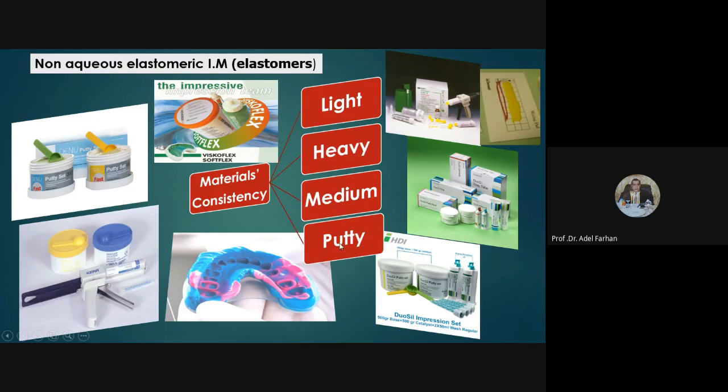طبعا الكونسستنسي تعتمد على شنو الاماونت اوف فيلر. كل ما يزيد الفيلر كل ما يكون الفيسكوسيتي مال الماتيريال شنو راح يصير عالي، كل ما يكون الفلوبيلتي مالتها اقل. كل ما يقل الفيلر بارتيكل كل ما يكون الفلوبيلتي مالتها اعلى. يعني لما نقول لايت هي تصير مثل الكريمي وشايفيها رابر امبريشن لما تخبطها بالبروستاتيك ماضي يصير شنو مثل الكريمه، فهذا يكون نسميه اللايت لانه شنو الفيلر بارتيكل قليل.